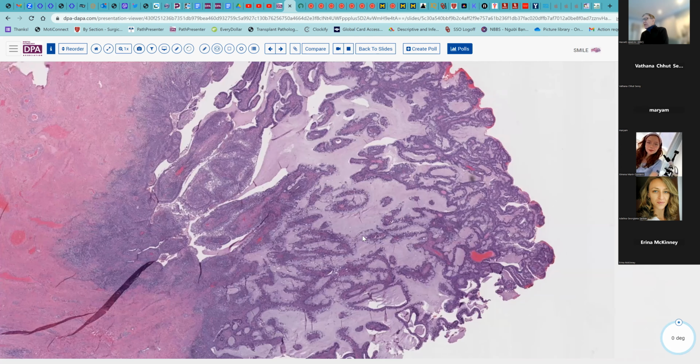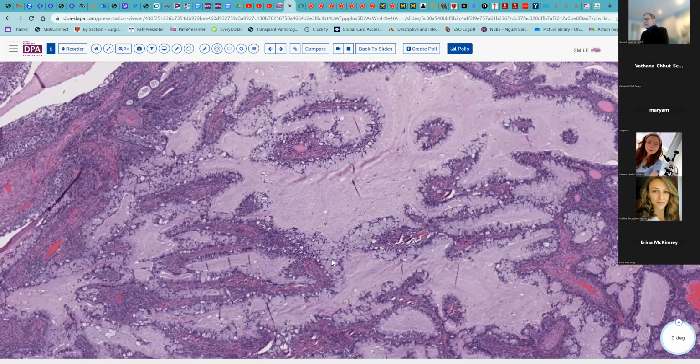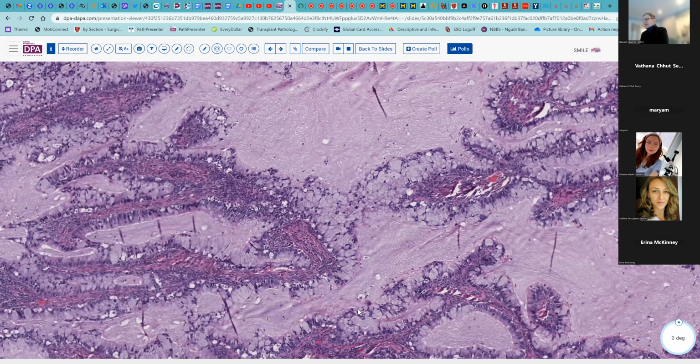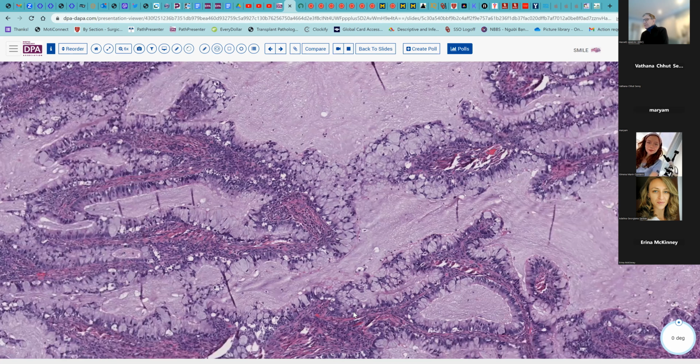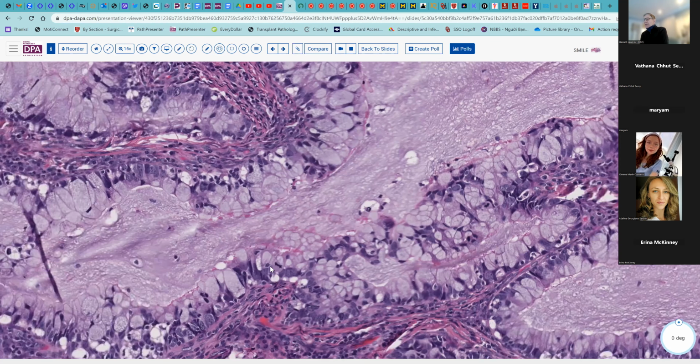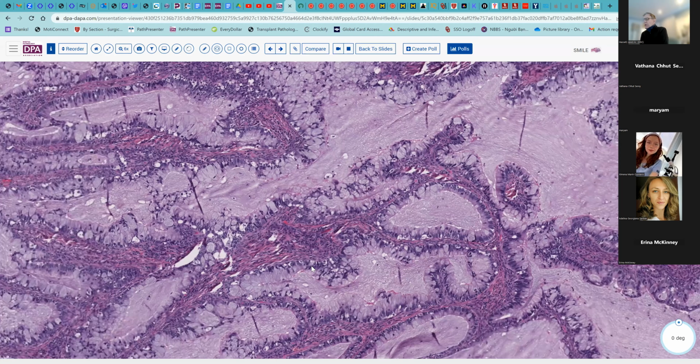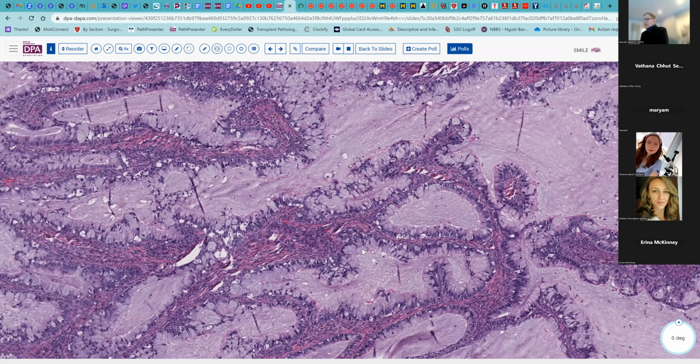And here, I think you would then begin to see that this is almost here entirely a mucinous neoplasia. This is intraepithelial carcinoma. Here we have mitoses, we have these very bizarre cells, and we have all of this mucin. So this is not conventional endocervical adenocarcinoma, because that doesn't usually produce this amount of mucin.